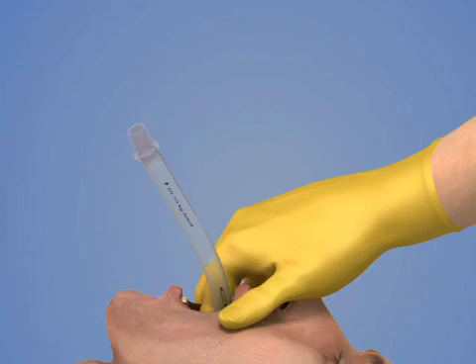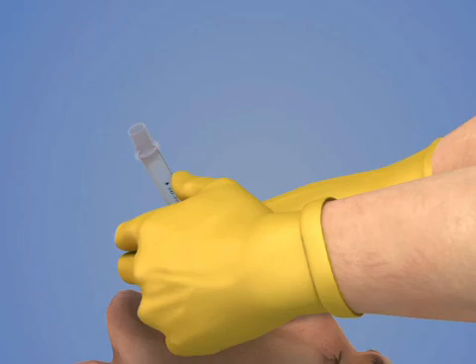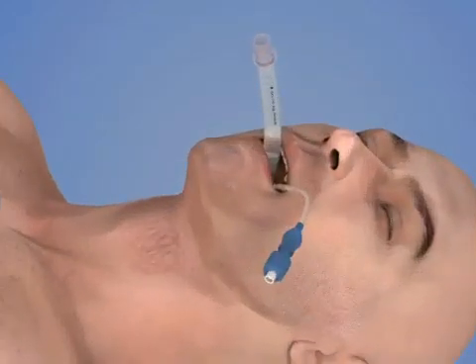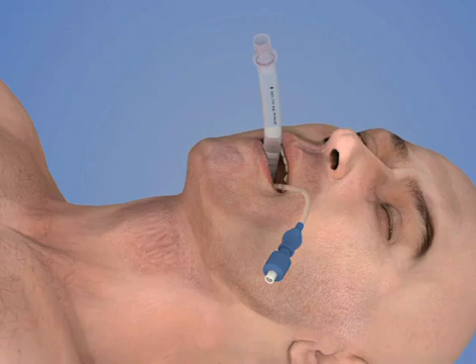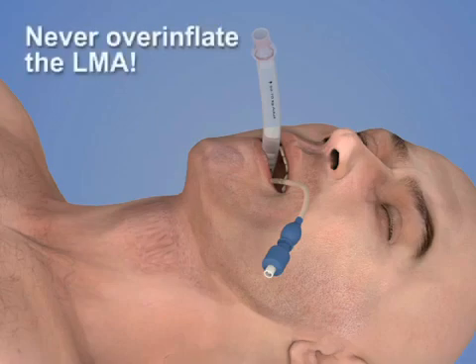Use your non-dominant hand to hold the proximal end of the LMA in place and remove your finger from the patient's mouth. Let go of the airway tube and inflate the cuff with just enough air to achieve a good seal with the glottis. This may require only half of the maximum cuff volume. Never over-inflate the LMA.